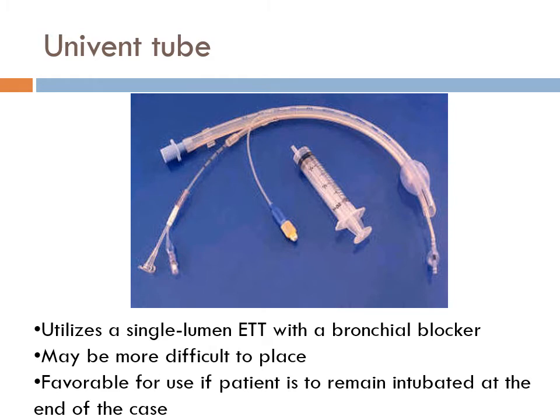If there's a question about a leak, and you look at the picture, maybe it's an entire operating room, and something might be off. The question asks, what's wrong? You could say maybe they're not getting a tidal volume. Maybe the picture shows it's 500 or 350. I'd ask you to pause and be able to determine that it's this, right? Do you see how we can apply these things?